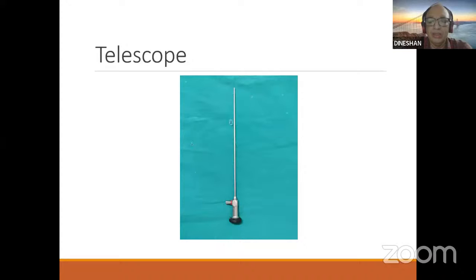Starting from the original days of incandescent bulb telescopes, now it has become more developed, more precise, mainly with the introduction of the rod lens system. Actually, the Hopkins system has revolutionized the whole endoscopy.